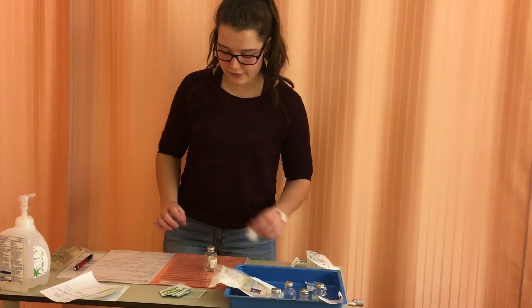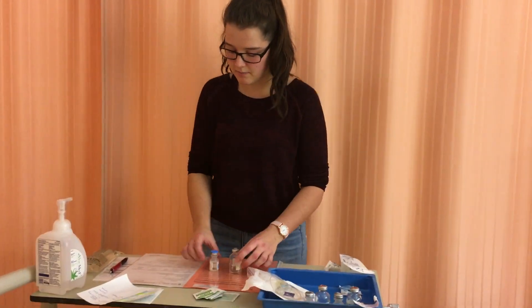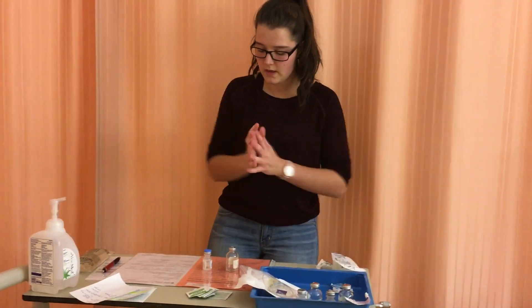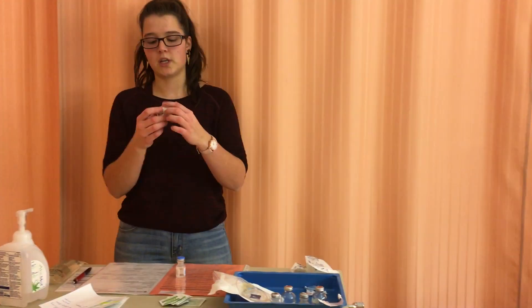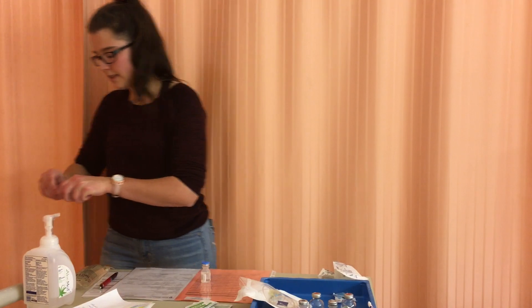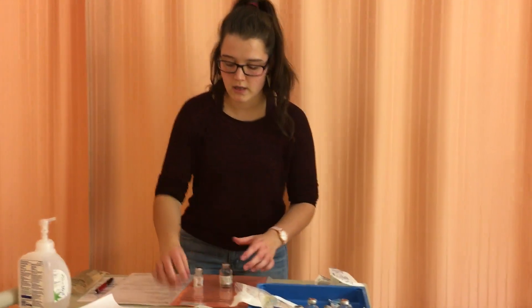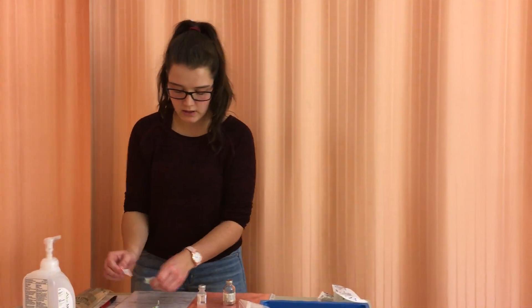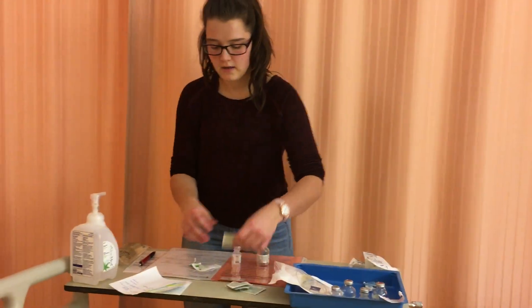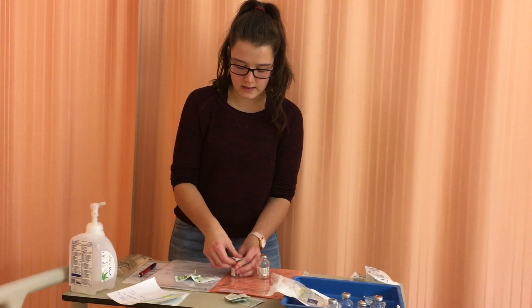I'm going to first dilute my vial with 6.8 milliliters of sterile water. I'll do hand hygiene first, then check that both the vials have expiration dates — they look good. I'm going to open these now and clean both — clean for 30 seconds and dry for 15 seconds each.